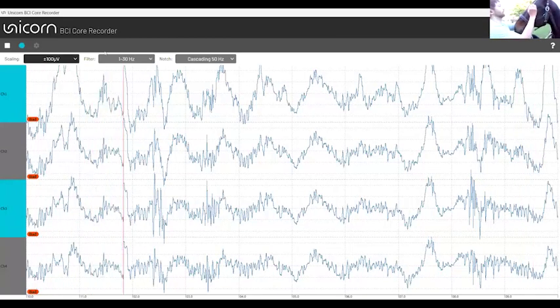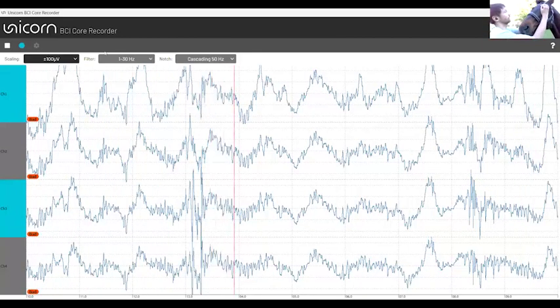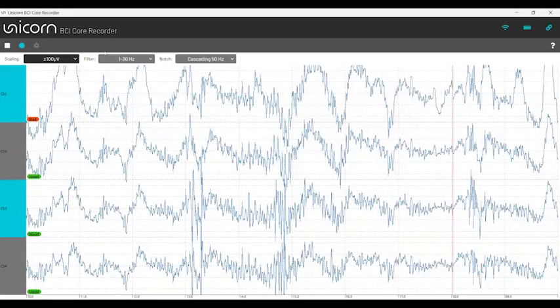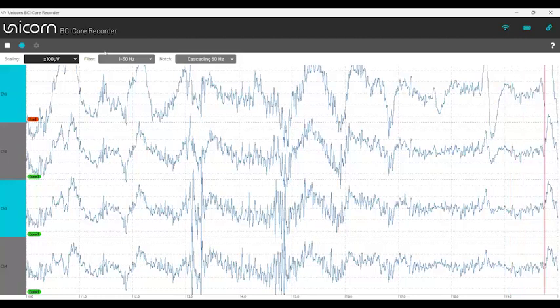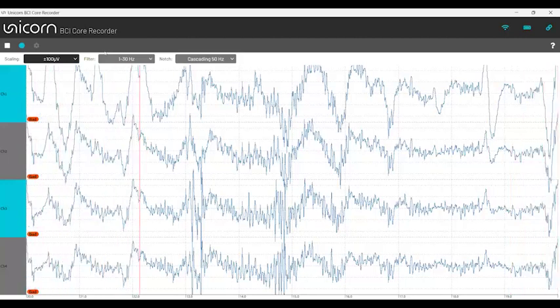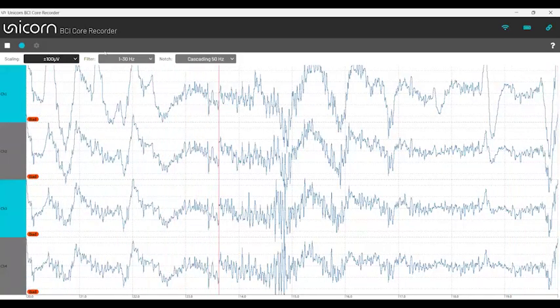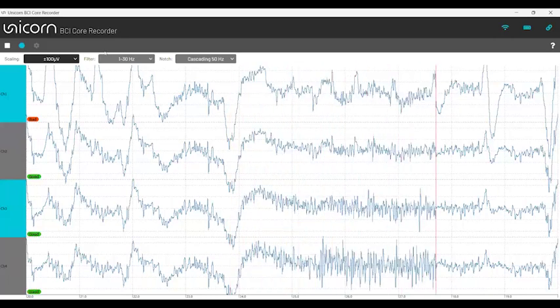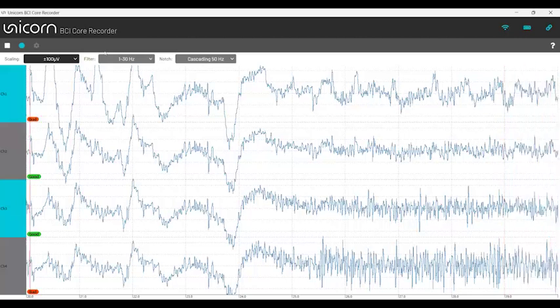I want to try this again. Let's see. Yeah, it's not coming so long again, but you can see the rising amplitude. The EEG is about double size. And interesting is also the magnitude of the EEG. So this is roughly plus minus 60 to 80 microvolts.